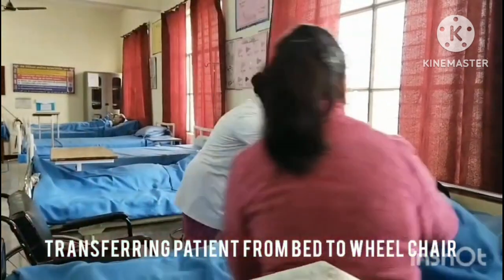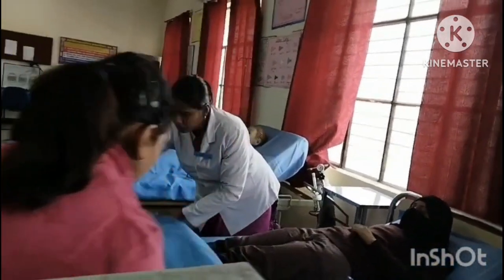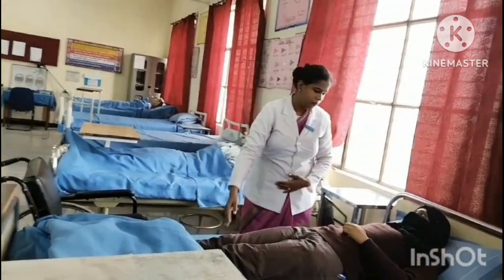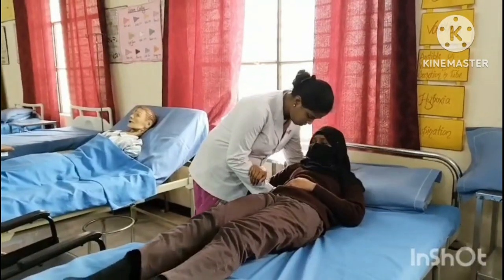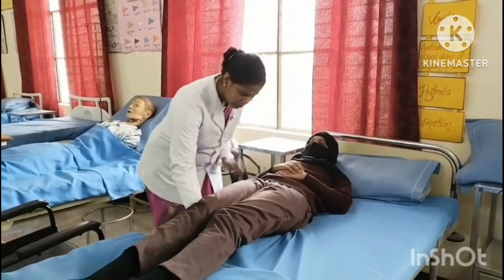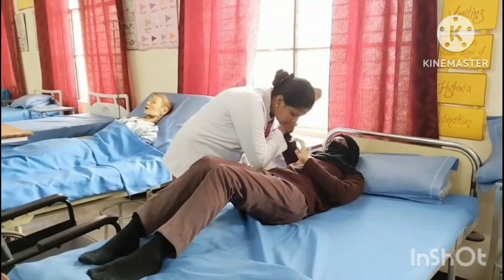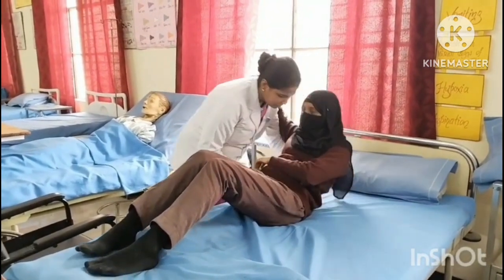Fan fold the top sheet toward the foot end. Slide the patient's buttocks close to the edge of the bed by shifting his weight alternately from right to left, until his feet are placed on the floor.